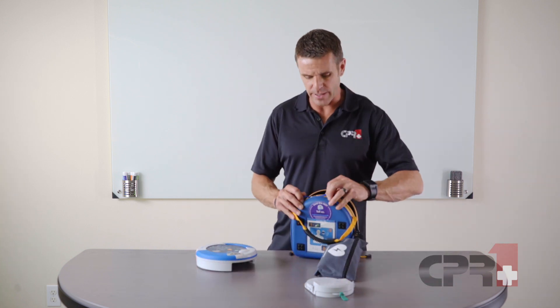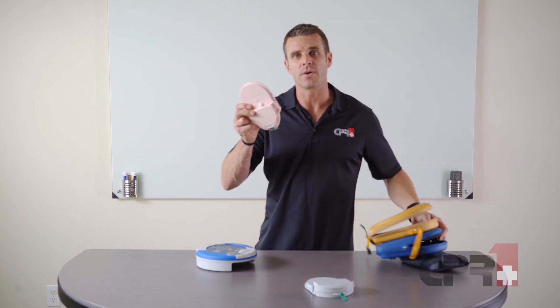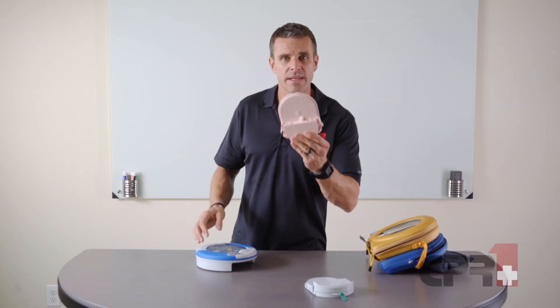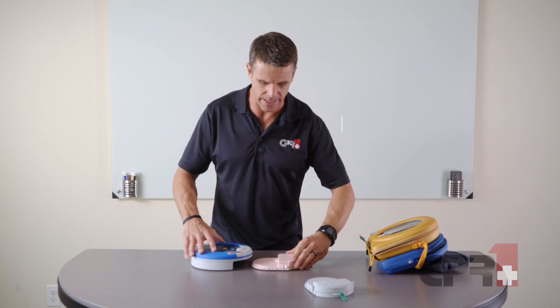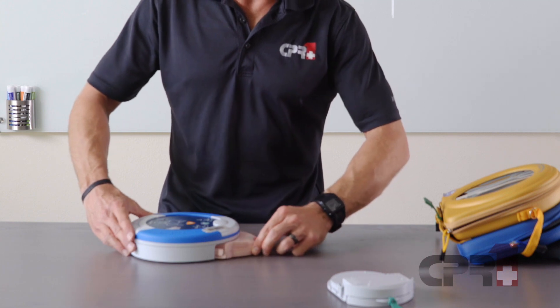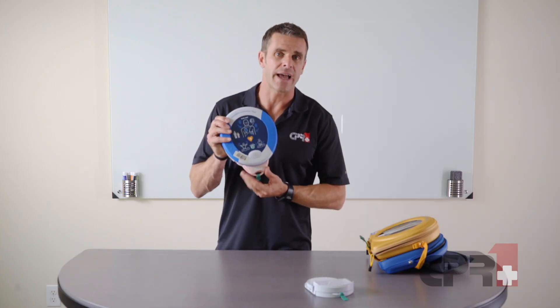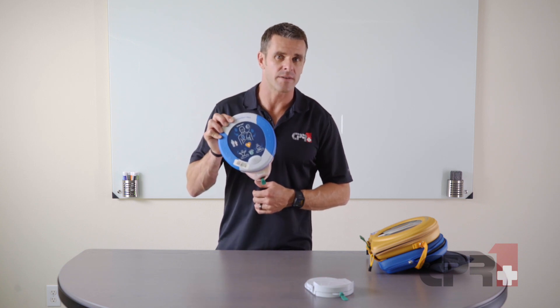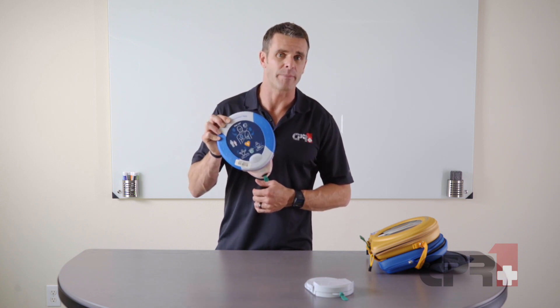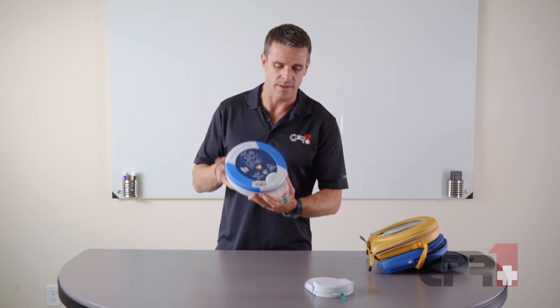In this case, I've got a set of pediatric pads in the back. The easiest way to insert the new pad pack is to actually place it flat on the ground and just slide it right into location. That's exactly the same process as with the adult pad pack, but if you have pediatrics at your site and you have a pediatric pad pack, that's exactly how you would switch it out in an emergency as well.